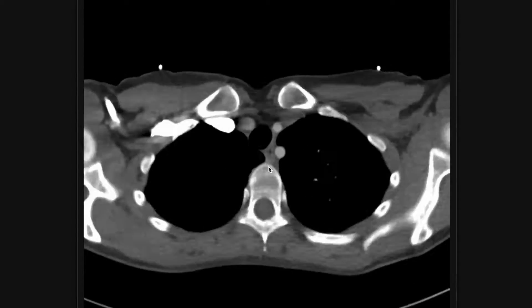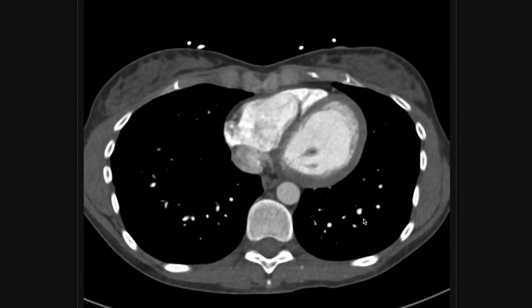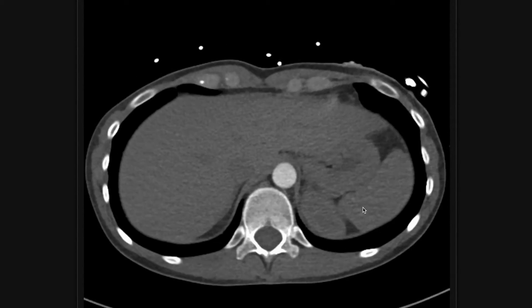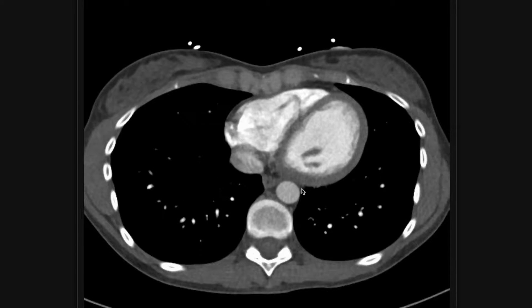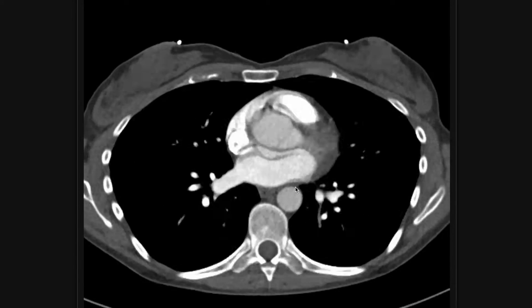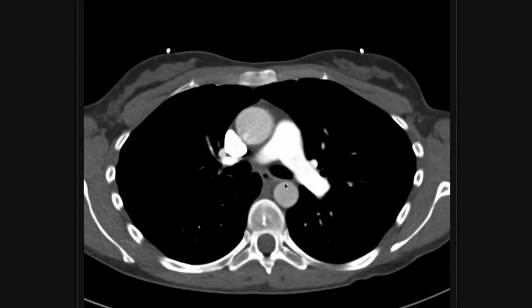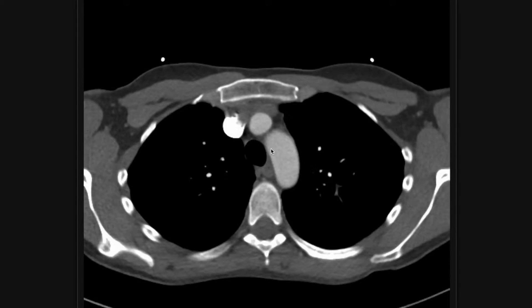In this case, there's no pulmonary embolus, so this is a nice normal study. After I have searched all the pulmonary arteries, I stay within the cardiovascular thought process and just look at the rest of the cardiovascular structures.